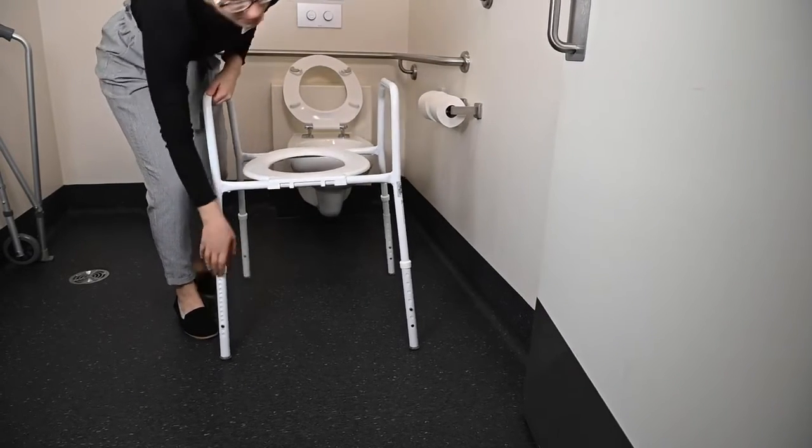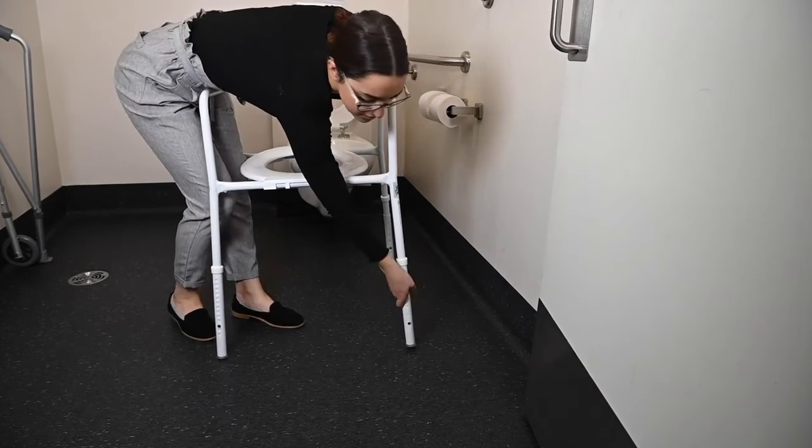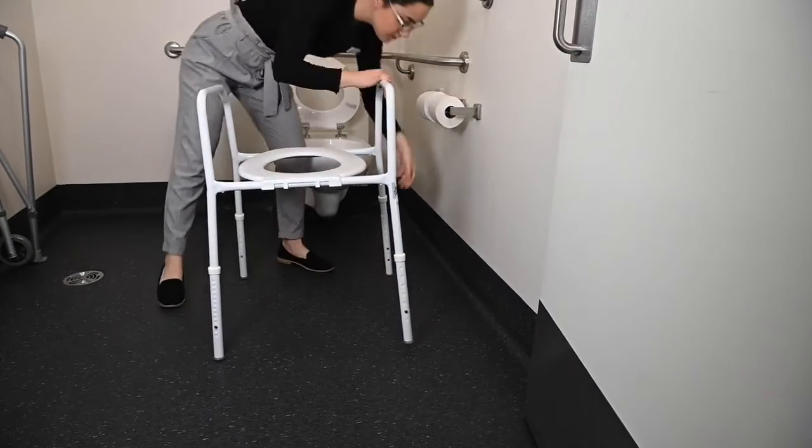Adrian leans down and adjusts the height of each leg of the chair by pushing in the spring-loaded clips until all legs are at the same height.